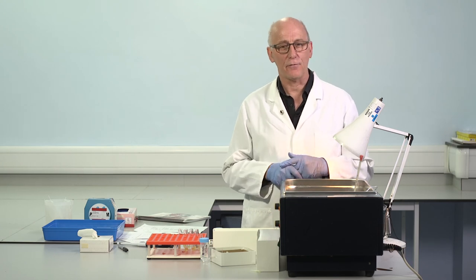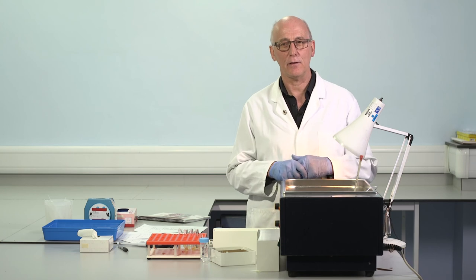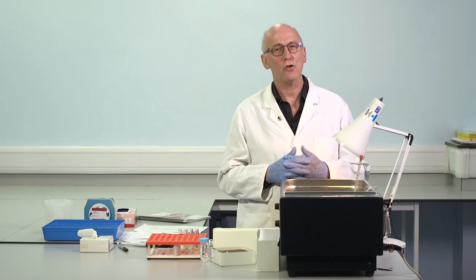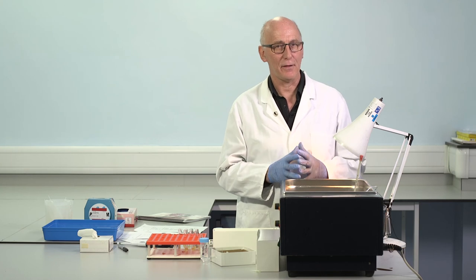Sometimes that's the cause of the difference in the different tests, but nevertheless, these patients do have mild haemophilia, and do have bleeding consistent with that. Therefore, we want to detect them, and they'll be missed by APTT. So we can't use a normal APTT to fully exclude mild haemophilia A.